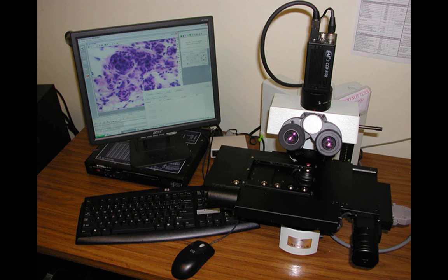Telepathology is a very good way for hyper-subspecialized people like myself to extend our coverage beyond just our immediate hospital. We can now provide expert intraoperative care to hospitals that don't even have to be in our state. They can be across the country. They can be across the ocean. In fact, a lot of times now, people are starting to do it at different institutions. They're starting to do coverage of, say, late-night frozen sections in Australia while their own neuropathologists are asleep, and vice versa.